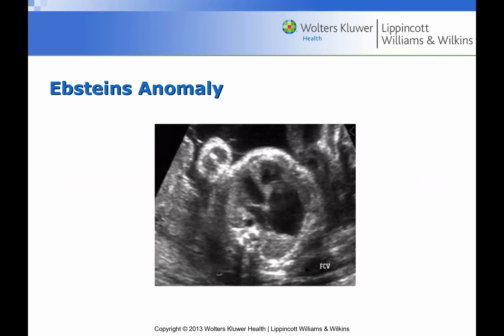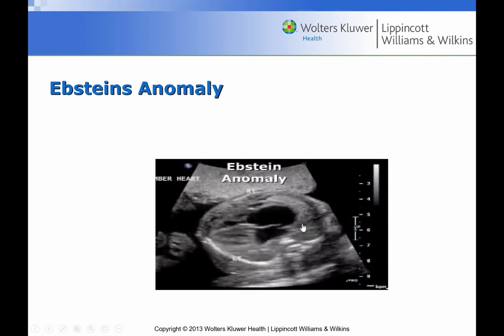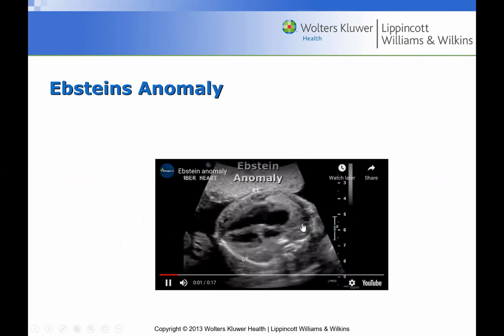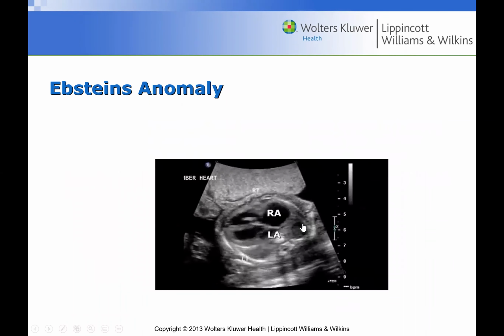So you can see here, this is abnormal. The right atrium is this large area here. You can see that it's much bigger than the left atrium.